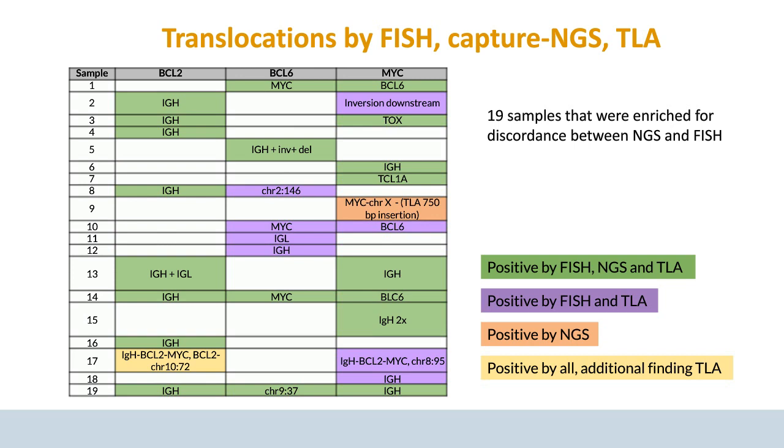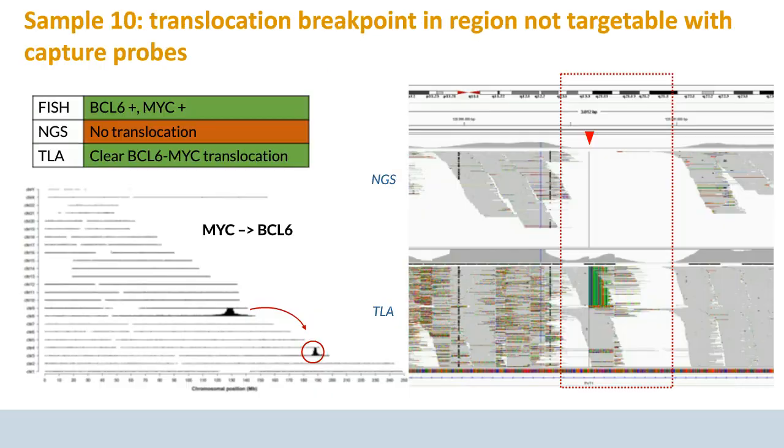And then we also had additional findings with TLA that were confirmed. So I'm going to show you two of the samples from the previous slide, how that actually looks with the NGS and how this looks with the TLA.